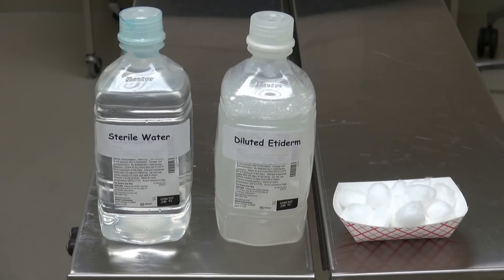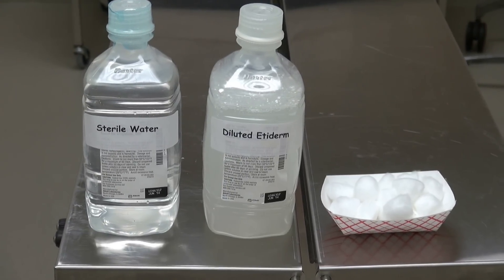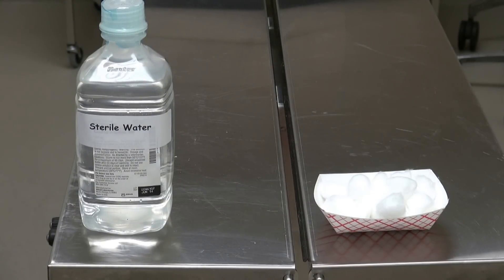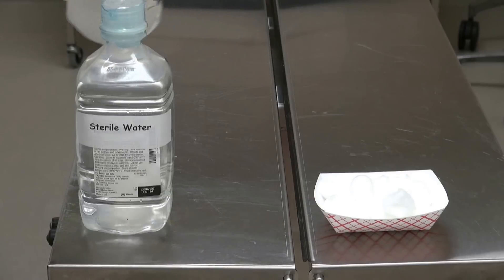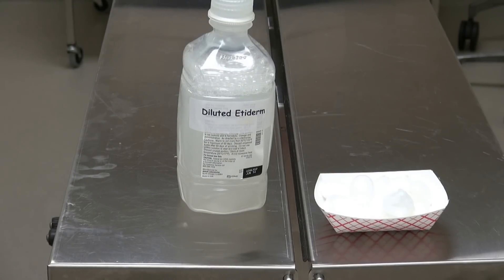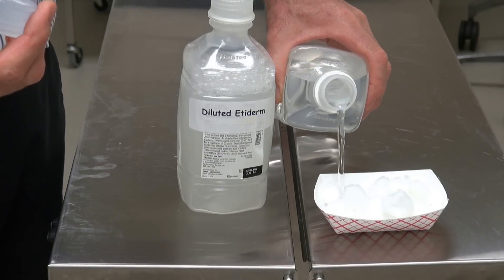Skin preparation is performed with a dilute solution of Etiderm soap. These dogs have extremely sensitive skin and are very prone to getting rather severe rashes if we use surgical scrub. So we're going to use cotton balls, this diluted dermatology-approved soap, and rinse thoroughly with sterile water. Additionally, wash the skin liberally with wet paper towels at the end to remove every bit of soap, as any residual soap will definitely cause a rash.